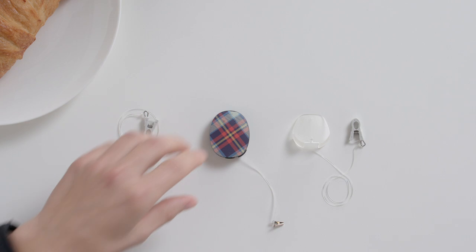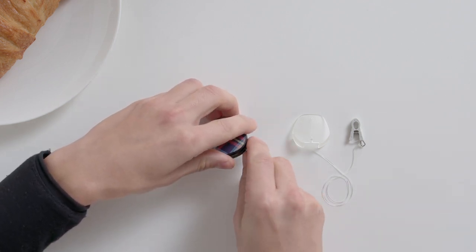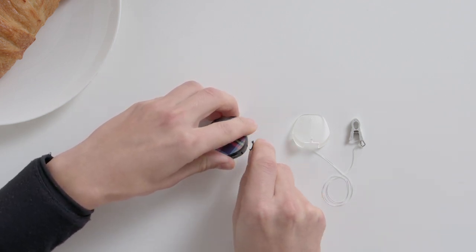To remove the clip, insert your fingernail under the lip closest to the rubber socket cover and gently lift the bracket off.